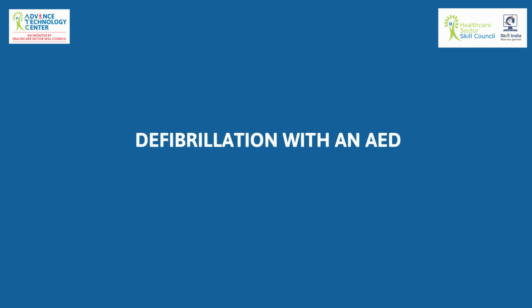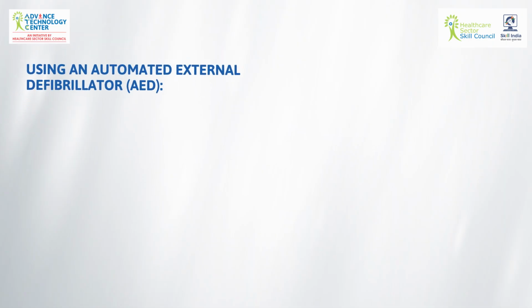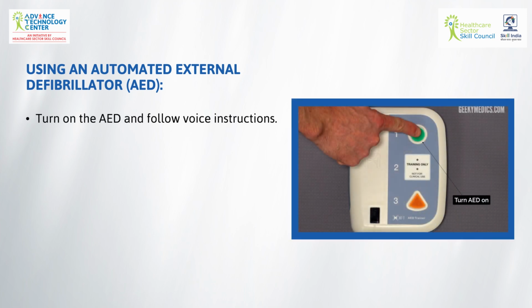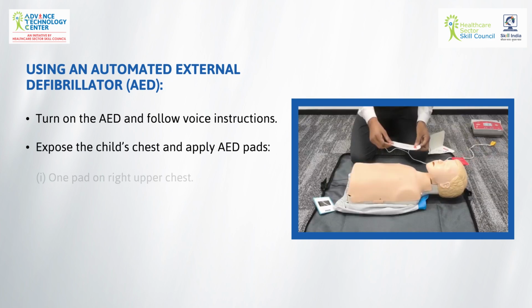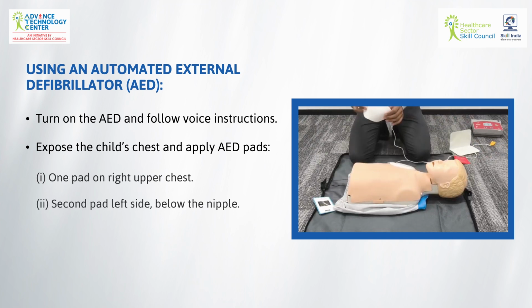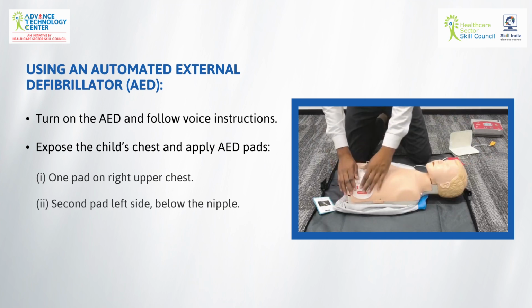Defibrillation with an AED. Using an automated external defibrillator, AED. Turn on the AED and follow voice instructions. Expose the child's chest and apply AED pads. 1 pad on the right upper chest below the clavicle. The second pad on the left side below the nipple.